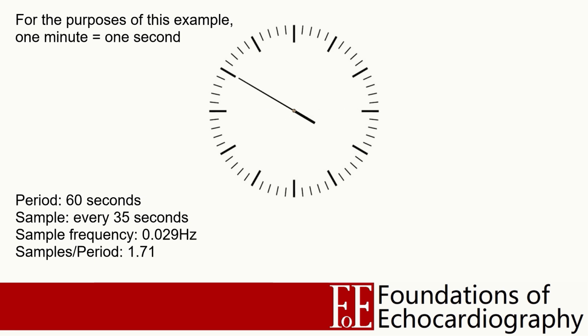The hand is rotating clockwise, and is rotating 210 degrees every 35 seconds, but we might easily confuse this with a slower anti-clockwise rotation. Indeed, we might imagine that the hand is rotating anti-clockwise at a rate of 150 degrees every 35 seconds. Because our sample frequency has dropped below twice per period, our interpretation of the returning signal has become inaccurate.